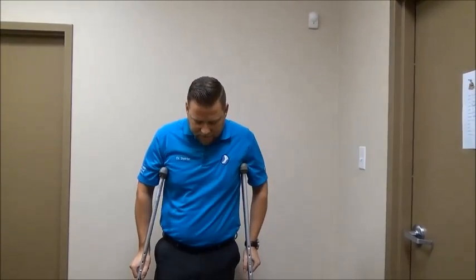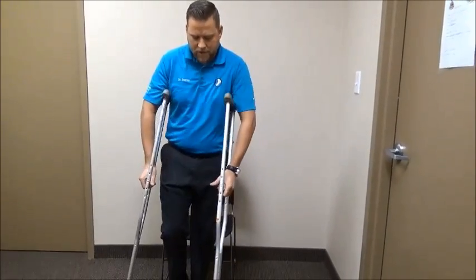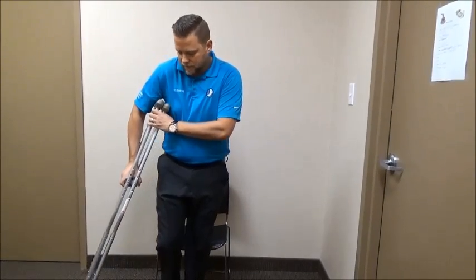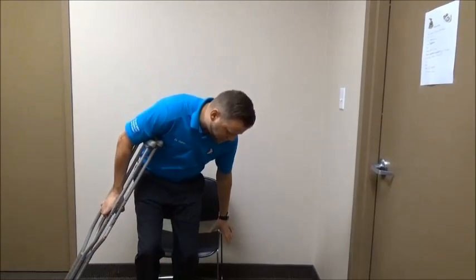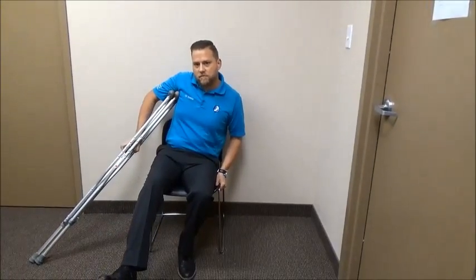Another challenge patients find is how to get up from a chair and sit down in one. To sit, back up slowly into the chair while keeping weight off your affected foot, then pass both crutches to the same side as the injury, holding them with one hand. Reach backwards with the opposite hand to grasp the chair, and use that to slowly lower yourself while the crutches help take weight off your bad foot.